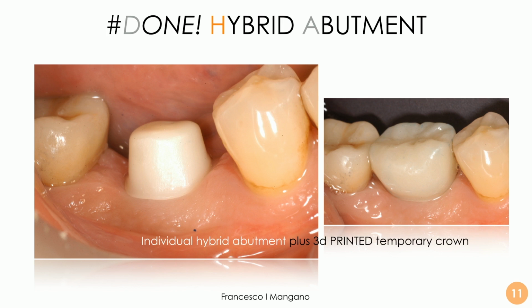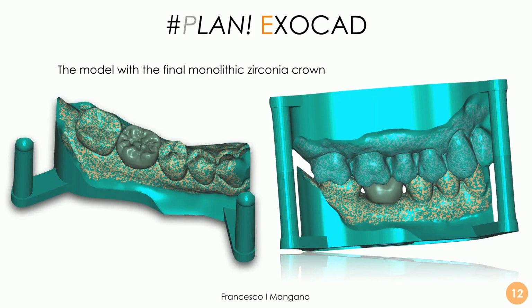There's a percussion hammer, and it goes in position with the conventional implant system, even conical with the screw. Then you need to screw it perfectly, and it stays there. You can use Teflon to fill the gap of the little hole for screwing, and then you can temporarily cement your temporary crown with a cement used for implants.